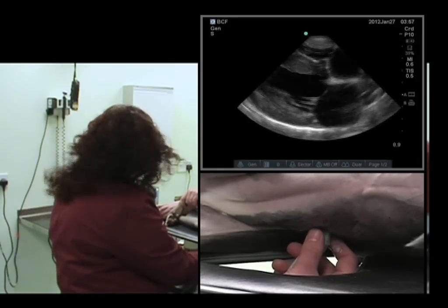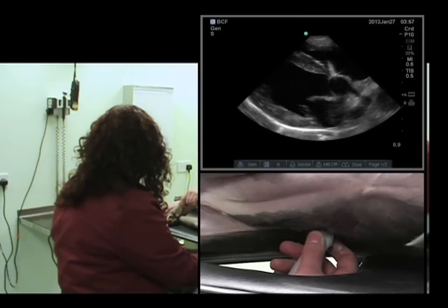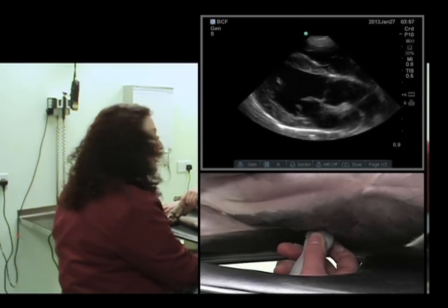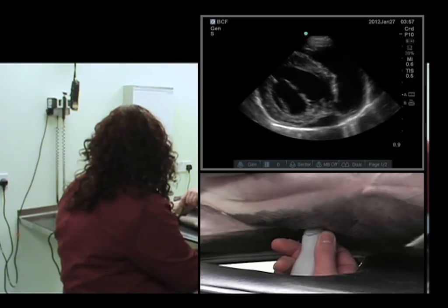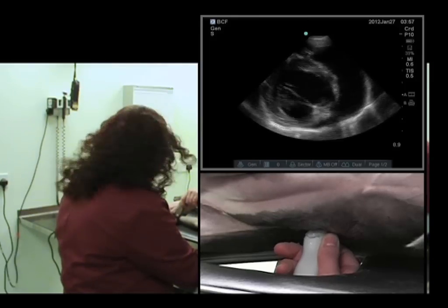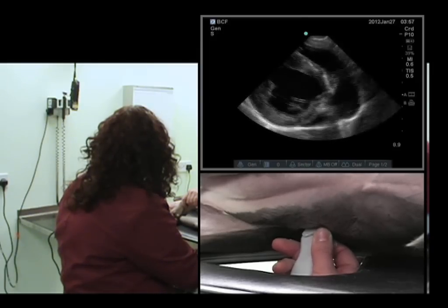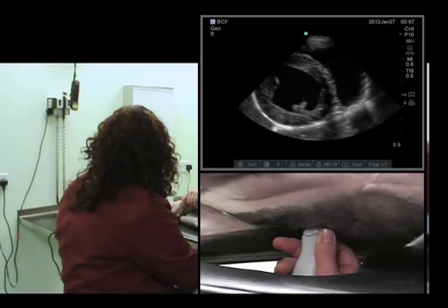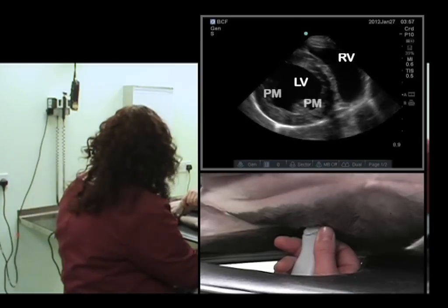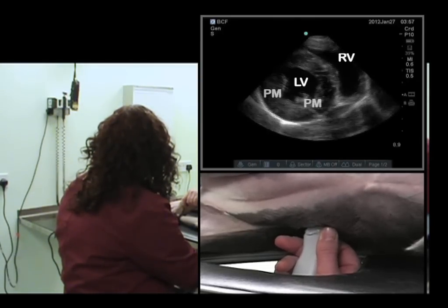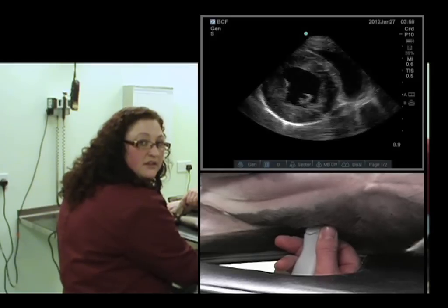We'll now look at the right parasternal short axis view. We'll rotate anti-clockwise — we'll see the outflow tract — and continue rotating anti-clockwise. We see the fish mouth view, which is the mitral valve leaflets. And now we're at the level of the papillary muscles. That is the right parasternal short axis view at the level of the papillary muscles.